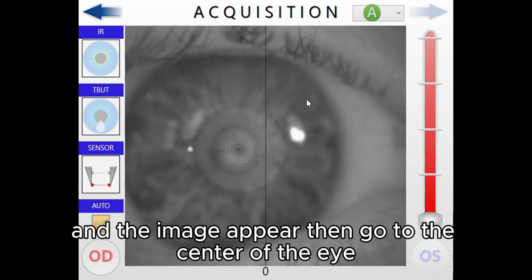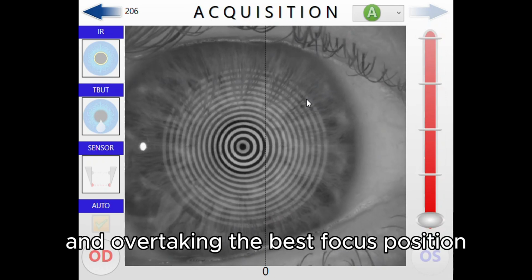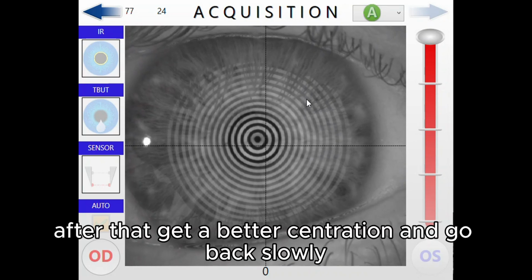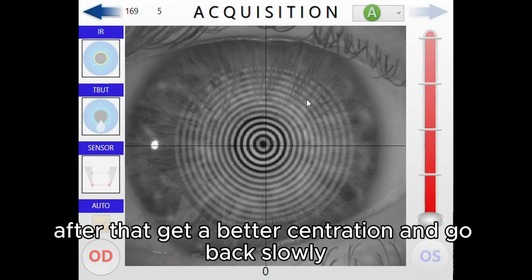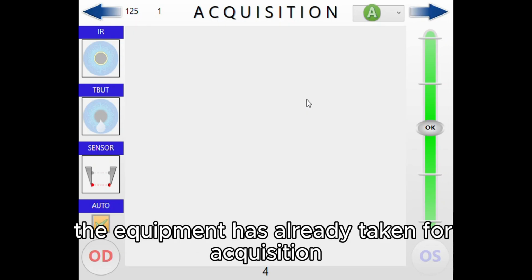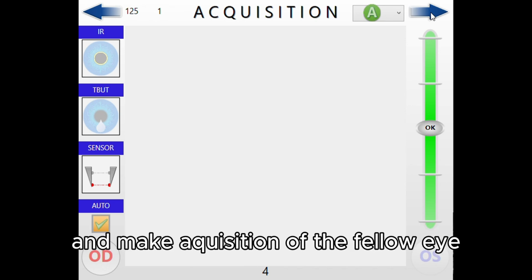and the image appears. Then go to the center of the eye, overtaking the best focus position, going closer to the eye. After that, get a better centration and go back slowly. Then in this case, the equipment has already taken the acquisition. If you want, you can move to the left eye and make an acquisition of the fellow eye.